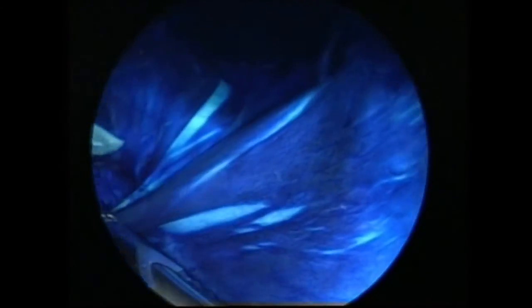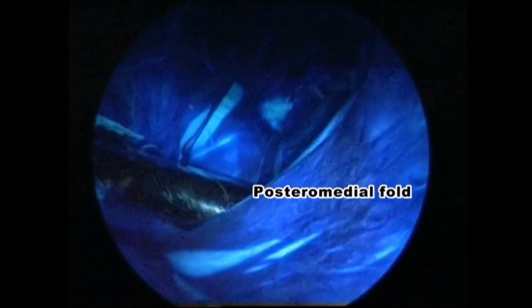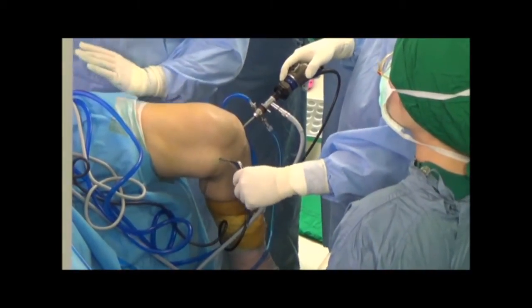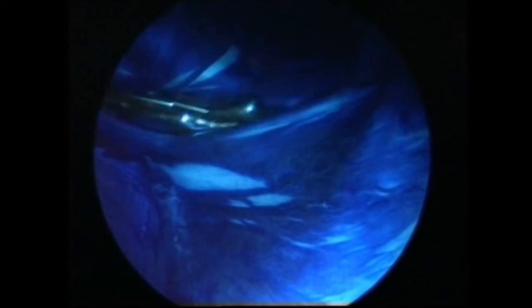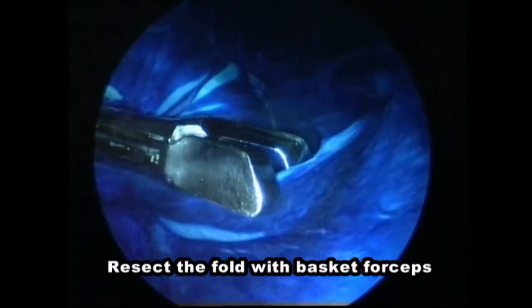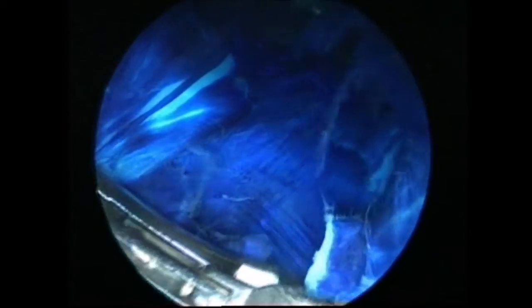You can see the posteromedial folds that create the valve mechanism through which the Baker's cyst has formed. The capsular fold was then partially resected by inserting the basket forceps into the posteromedial portal.